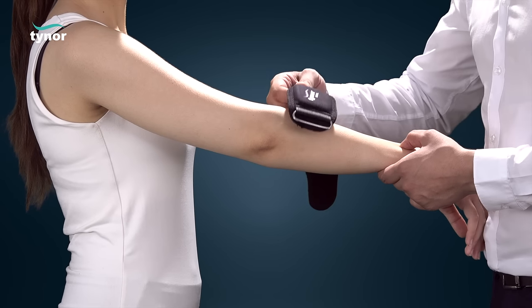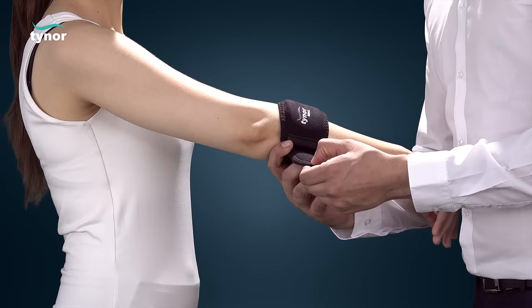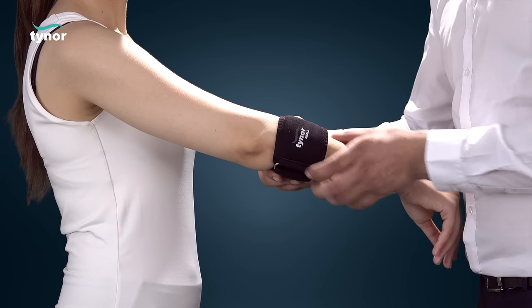Position the pad exactly on the point radiating pain, or as directed by a physician. Tighten the strap until the fit is snug yet comfortable.